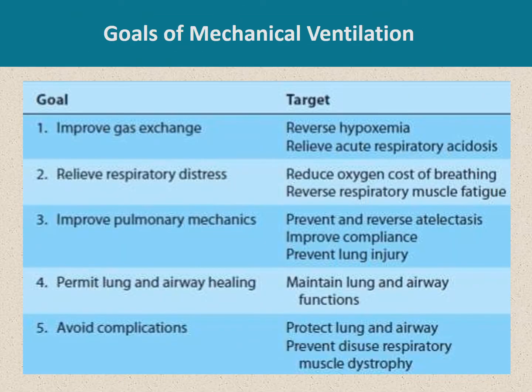The goals of mechanical ventilation are basically to reverse the causative pathology that caused respiratory failure, like improving gas exchange and reversing hypoxemia and respiratory acidosis, relieve respiratory distress and reduce the oxygen cost of breathing like in patients with circulatory failure, improve pulmonary mechanics to prevent and reverse atelectasis and improve compliance, permit lung and airway healing, and maintain lung and airway functions while avoiding complications.